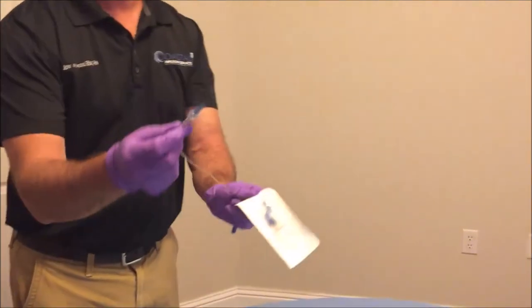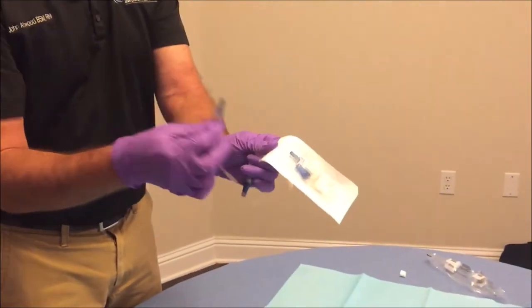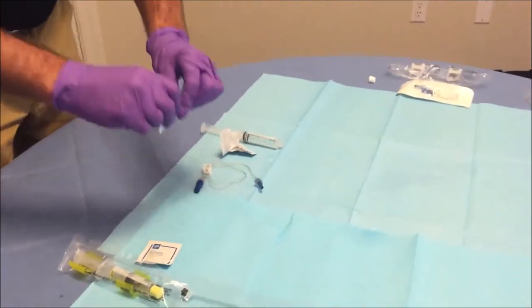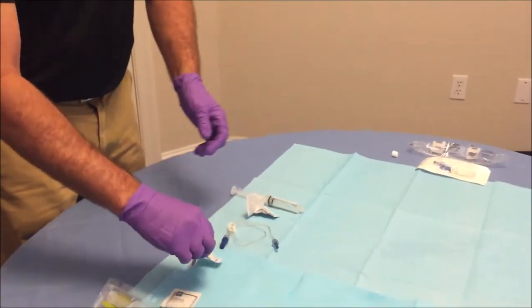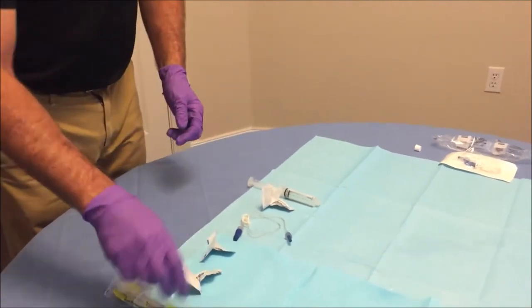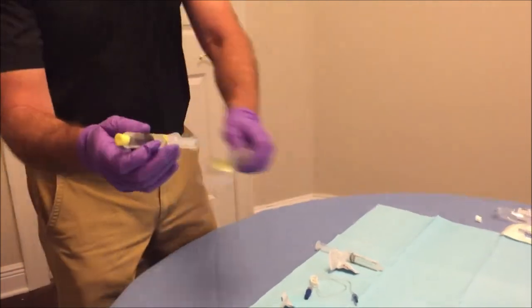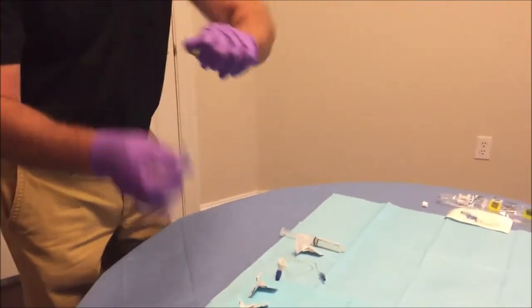The extension set will look like this when it comes out. Be sure to leave the smaller blue cap connected. Open the rest of your alcohol preps, open your heparin syringe package, and then remove the yellow cap.